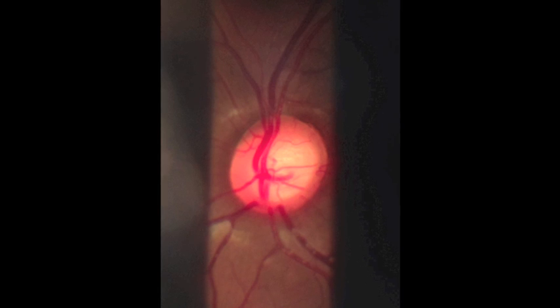To view different areas of the retina, you will need to ask the patient to move their eyes and tilt the lens. For example, if you want to view the superior retina, get the patient to look upwards and tilt the top of the lens towards you.